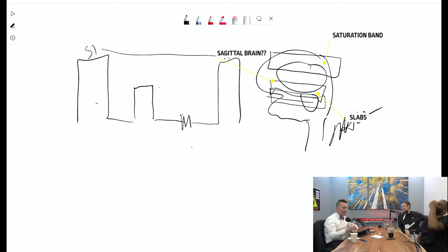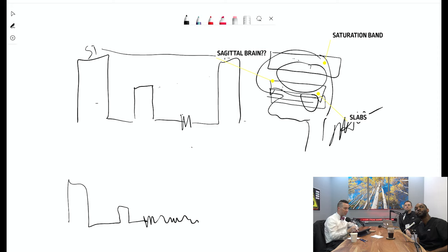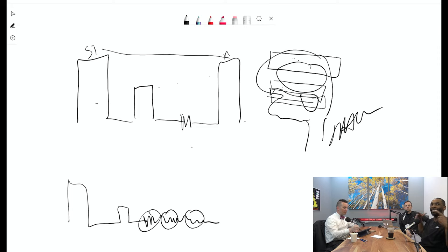What you can start to do now is, right now it's inversion, readout. But now you can start to do inversion and readout, so you can do two or three readouts. That's something new. You're packing that in tighter. And it'll tell you that your TR is longer, but that's okay. What you're worried about here is venous signal starting to ease in and not be so dark. But it works really well.